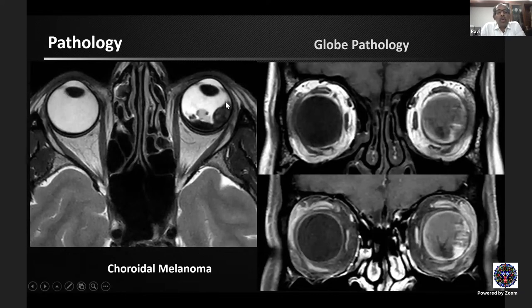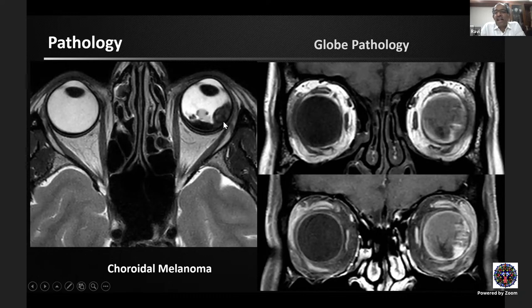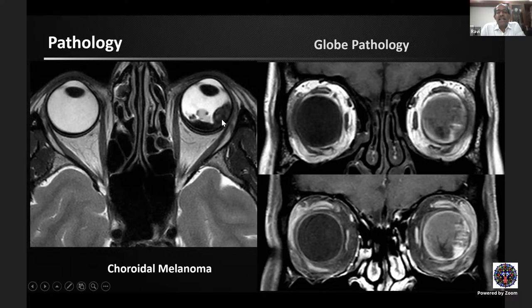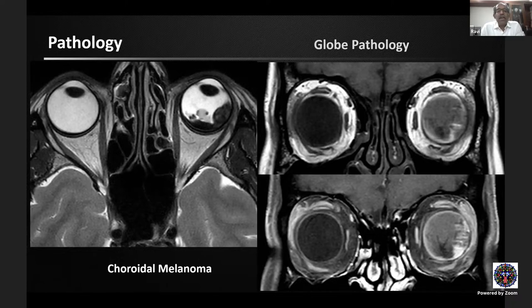Choroidal melanoma has a characteristic MRI signature due to melanin: it is very dark on T2, bright on T1, and shows intense post-contrast enhancement — enabling a positive diagnosis. When a typical T2 hypointense signal is seen, it indicates either a hemorrhagic or melanotic lesion, helping narrow the differential from metastasis and other lesions.